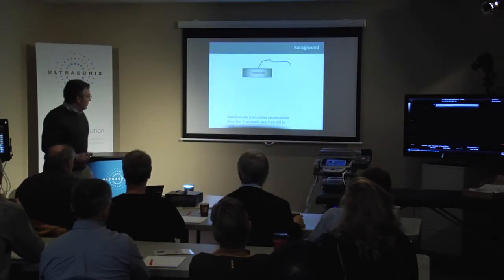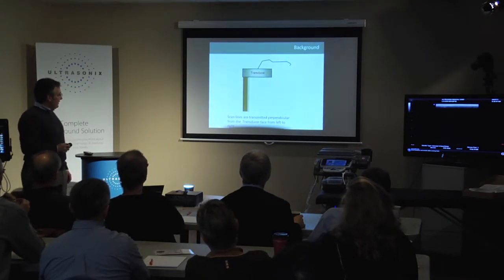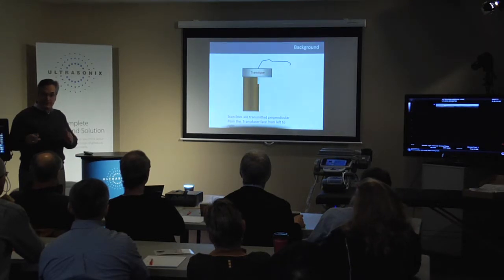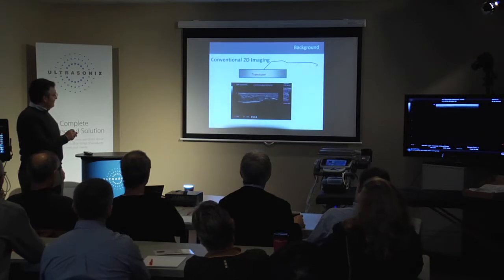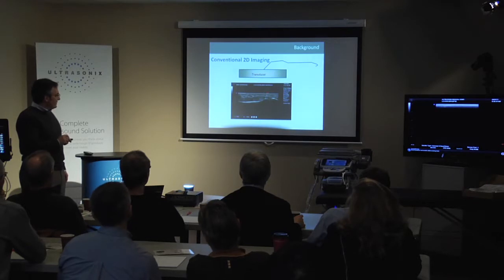So in the conventional technology of a transducer, we have electronic steering of the echoes that are sent from the elements in the crystal or the transducer head. Emitted, they interact with the body, they hit various structures at different densities and depths. They echo back, and we collect all those return echoes. The sequence of firing is left to right. Just to be rather fundamental, there is our transducer, sitting on the skin, emitting echoes in and collecting them on the return.